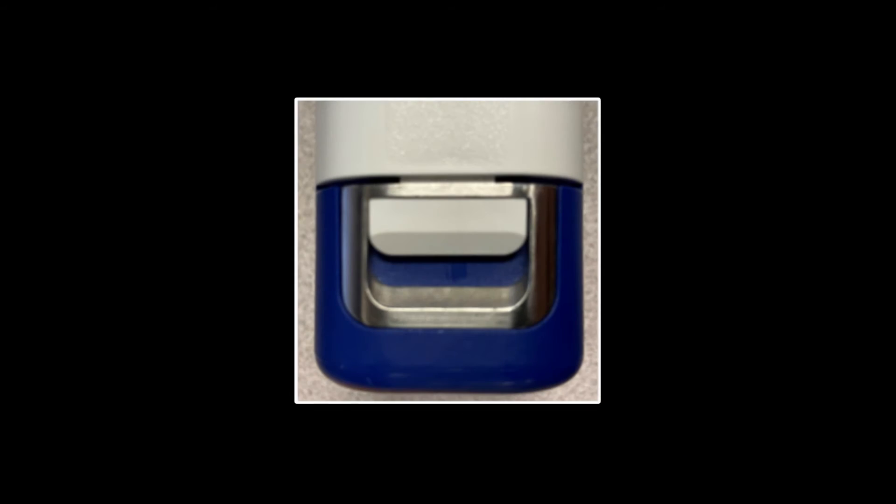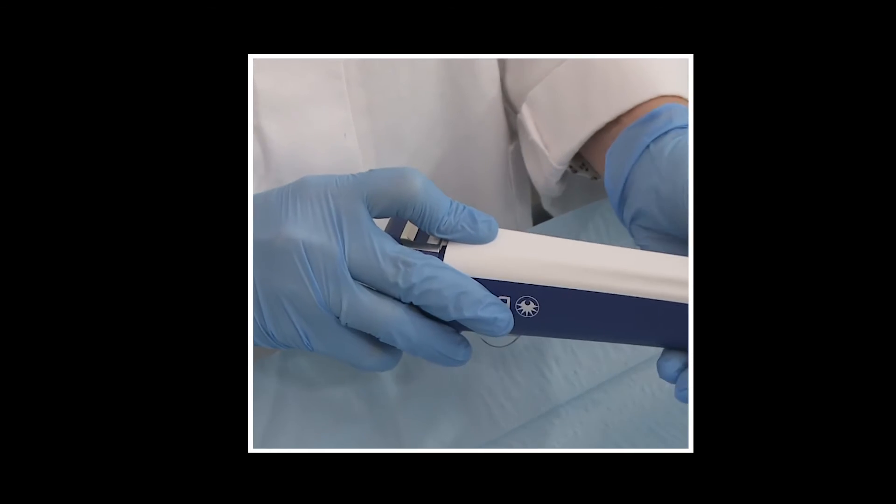Regardless of the method used, confirm the probe rear tab is locked into the driver after loading. The white locking tab should be completely under the metal bar. You will hear a click when it's in the correct position.